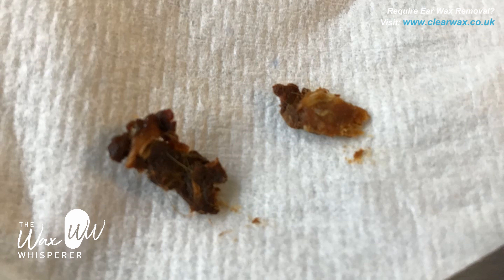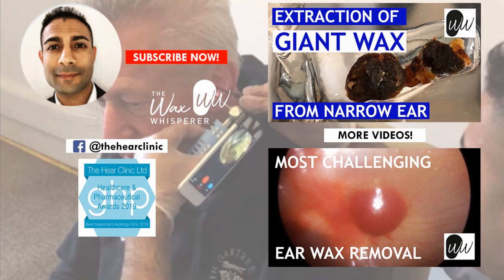So those are the two plugs. The one on the left is the more medial one near the eardrum — you can see it's darker in colour. The one to the right was the more lateral, fresher layer of skin and wax. I hope you enjoyed that video guys and you're all having a lovely Easter weekend. Thank you, bye!